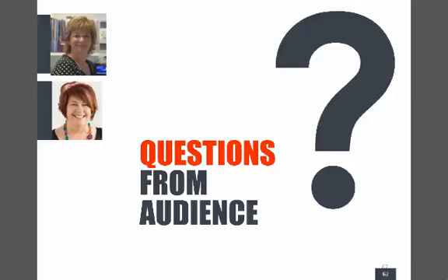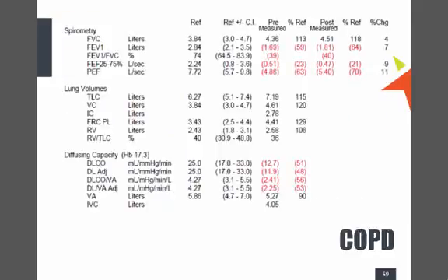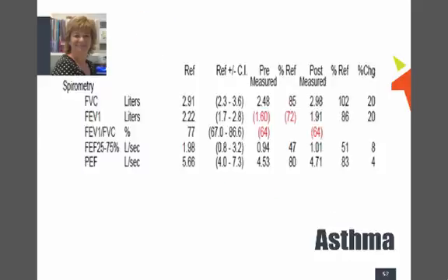Okay, so can you tell us then how that translates into what you see, or how you see that difference in the numbers? Okay, we'll go back to the asthma slide. I think it's 200 mils for asthma. So just to go back, it'll be in the guidelines?